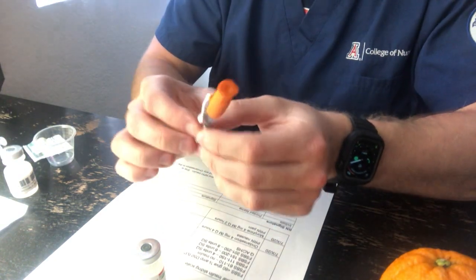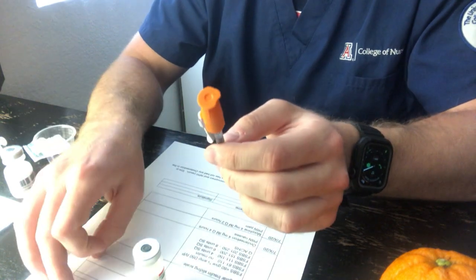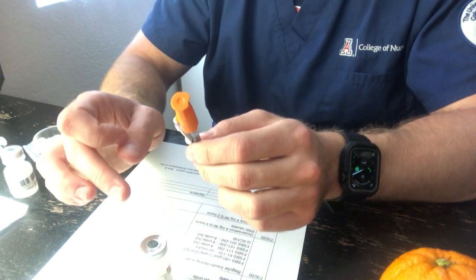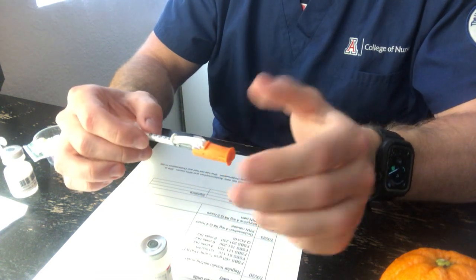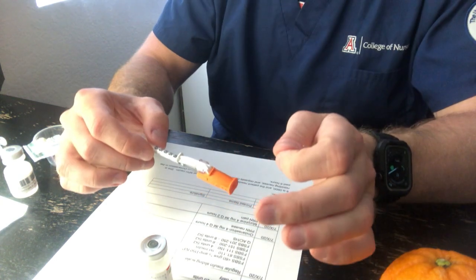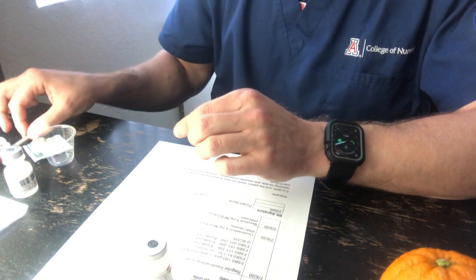I'm going to have a nurse verify with me that this is 20 units of NPH insulin for the right patient, to make sure I go over the 5 rights with her and she verifies everything for me. So I have the correct insulin syringe. I have pulled 20 units. I've put the safety cap back on, had an RN verify it. I'm going to set this aside with my acetaminophen.